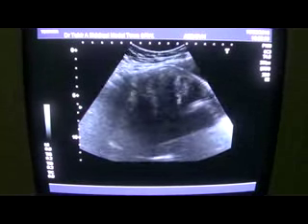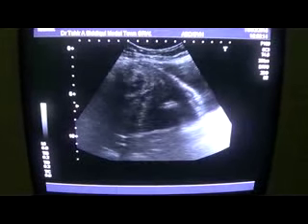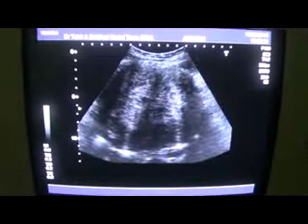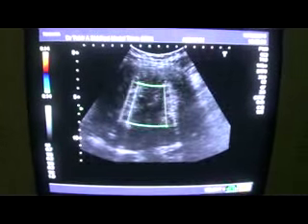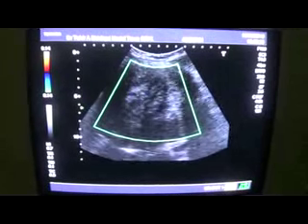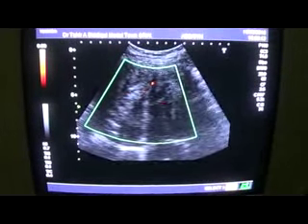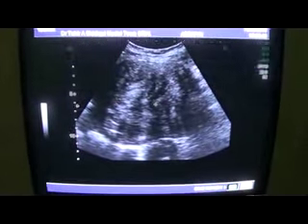anteriorly. And the reason why she does not have any menstrual disorder, she says she has regular periods, no issue with that, is because of this large solid mass relating to the posterior wall of the uterus, with no significant vascularity, though a few vessels are seen. However, there is no significant vascularity seen, and this is the area from where we can get its real dimension.